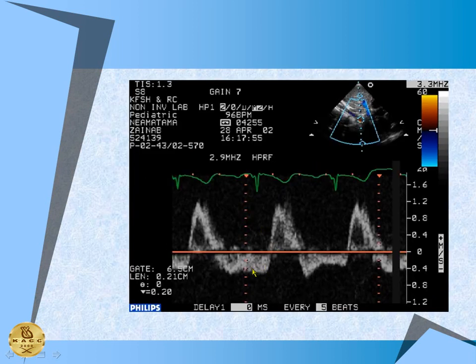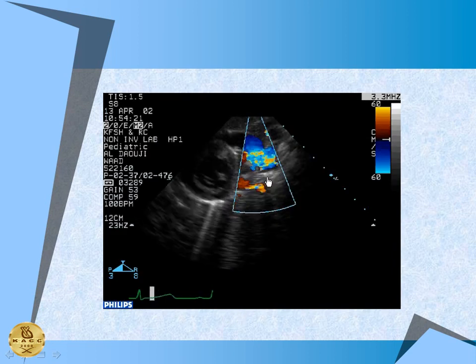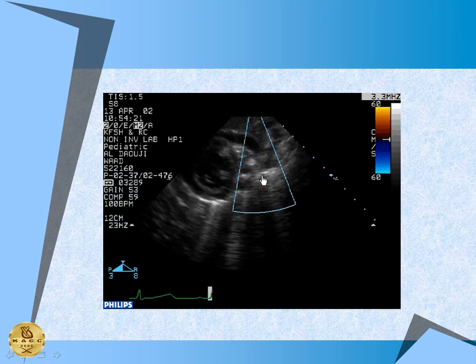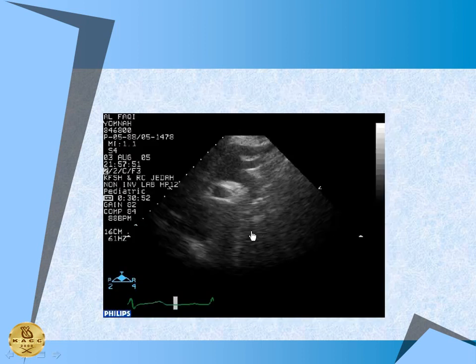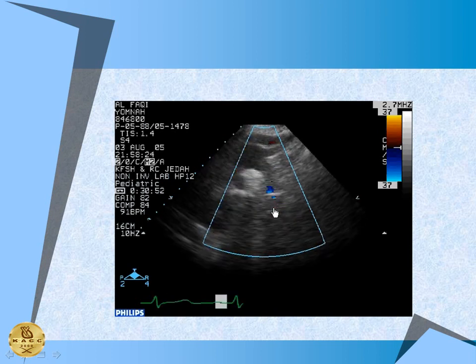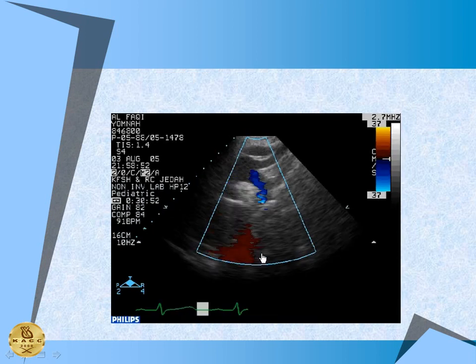This is a patient with the retrograde flow in a PDA. You see, in coarctation, we saw the anterograde flow. Again, a very tight coarctation here. You see, it can get as near atresia. It can be long segment and low. Again, the same.